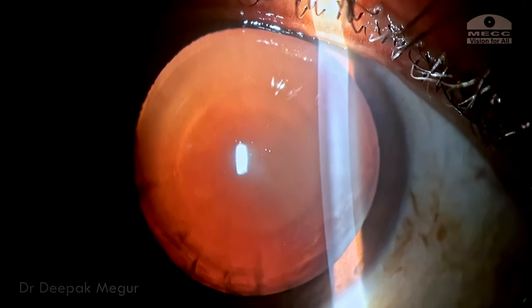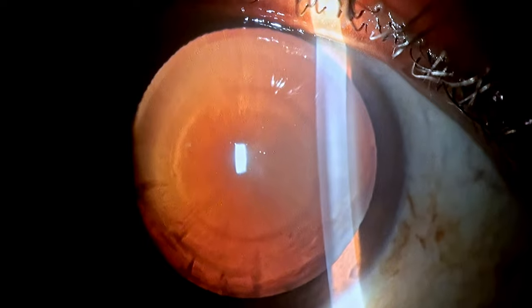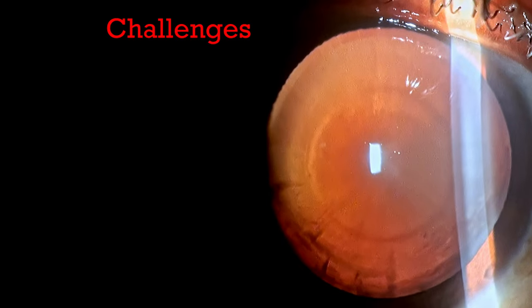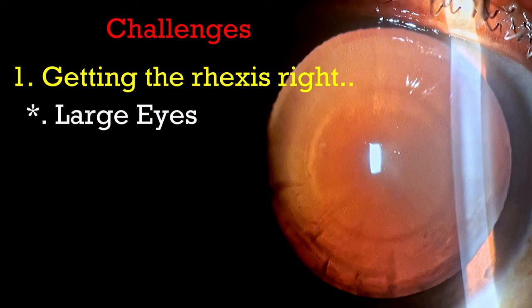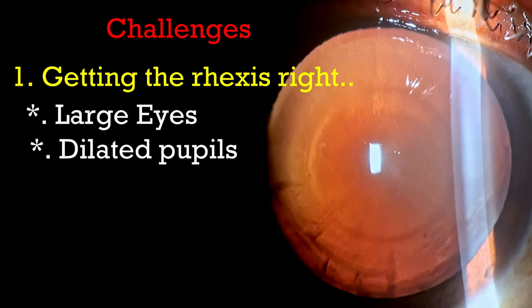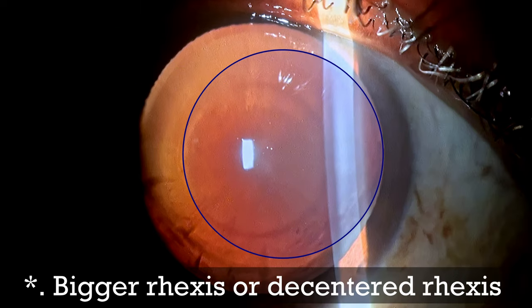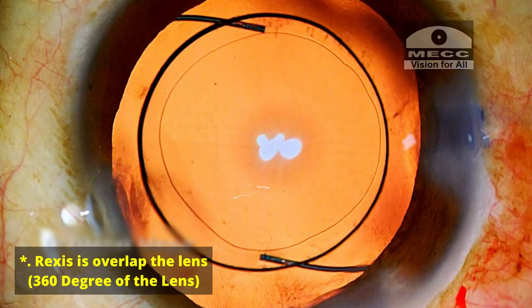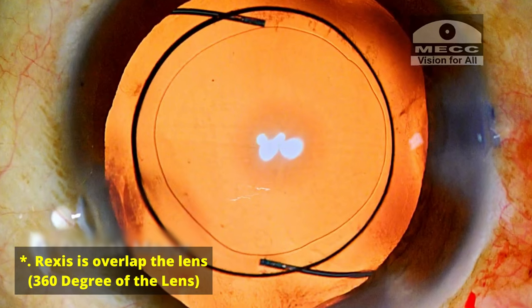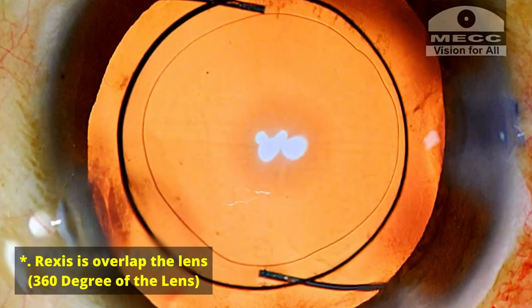Before performing surgery, these are some of the points I will be mindful of. Intraoperatively, one of the challenges I'm going to face is to get the rhexis right, because these eyes are huge. The pupil will be extremely well dilated and sometimes we may err on a slightly bigger or eccentric rhexis. We want the rhexis to overlap the lens 360 degrees, which ensures that the lens adheres to position and we can achieve better centration.